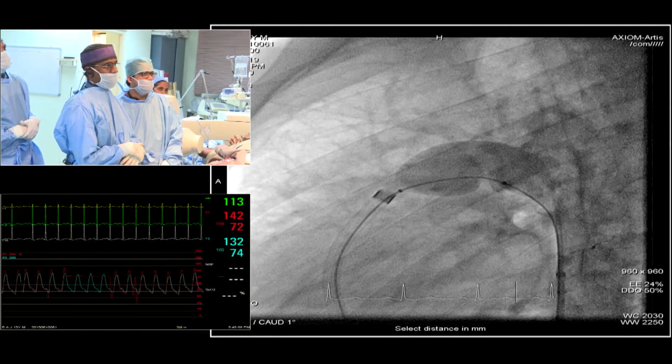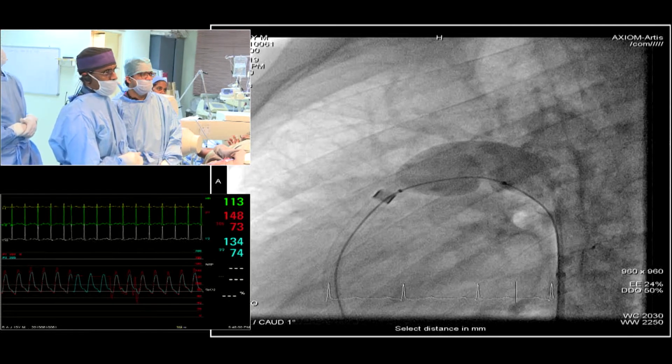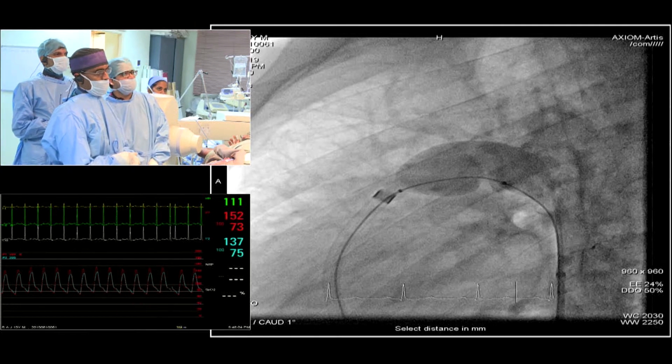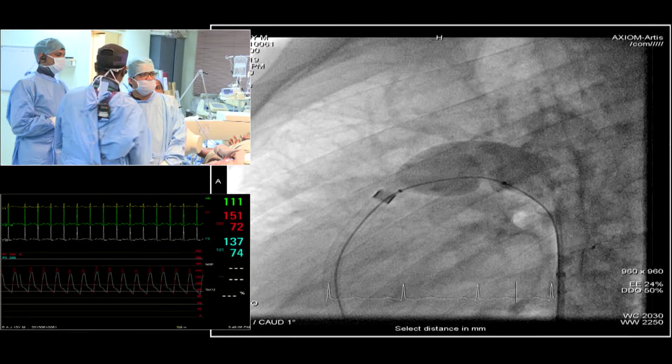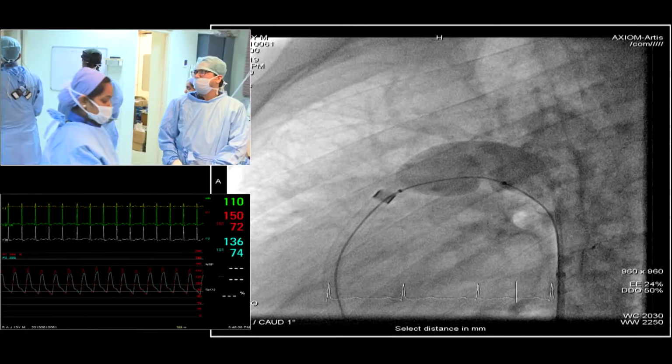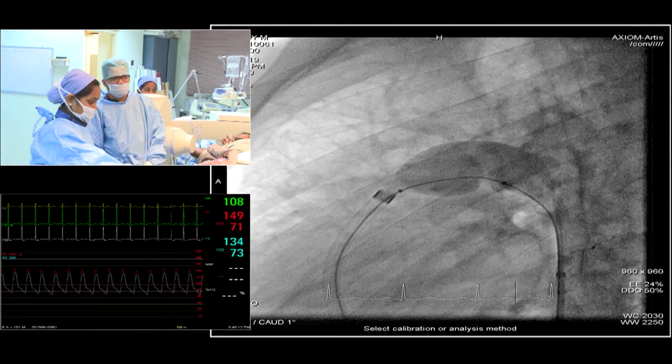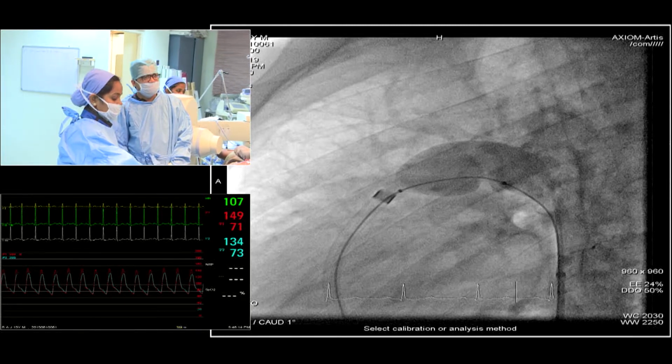No, not that way, that cannot work. We cannot see the measurement on our screen. Basically it is done on another computer. It's okay. Now accept it as 30 and then give a measurement.